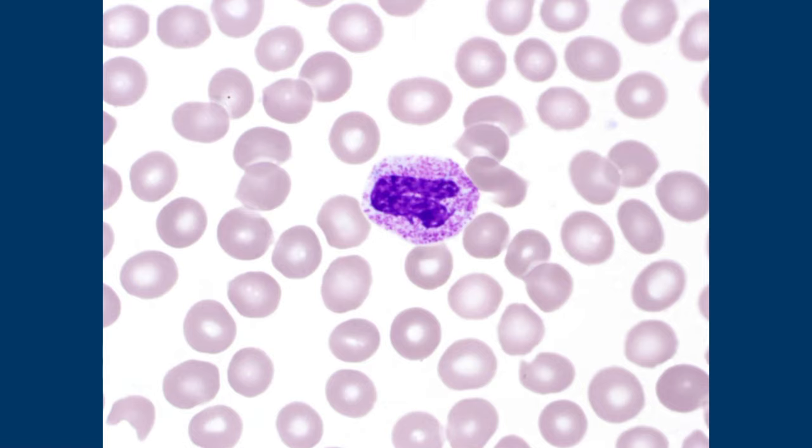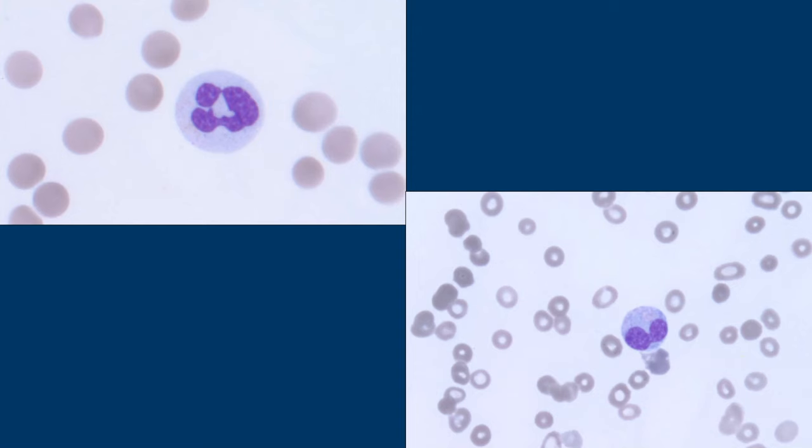Here are hyposegmented neutrophils — they still have segments, just two of them rather than three to five. This is different from a band, which just hasn't segmented yet. This hypogranular cell — it's lost all its granules — that's a dyspoietic feature, potentially seen in myelodysplastic syndrome. Dyspoiesis means there is a problem in the formation process. Granulopoiesis means the formation of granulocytes; erythropoiesis means the maturation of erythrocytes. Dyspoiesis means it's not forming the right way.